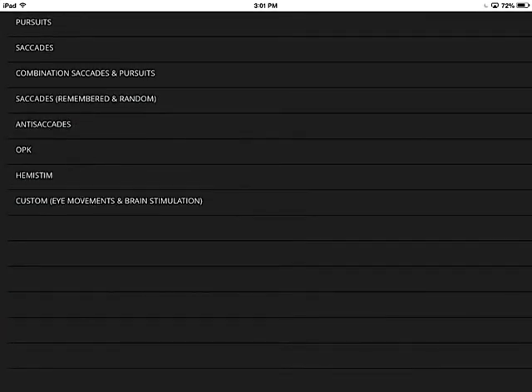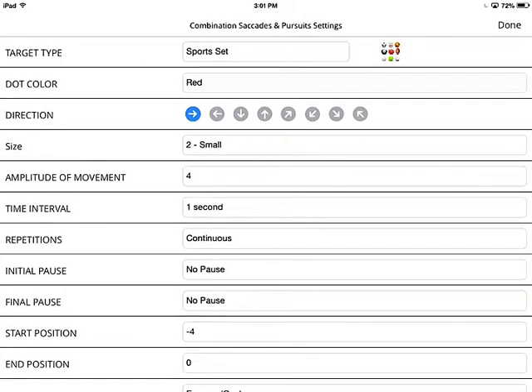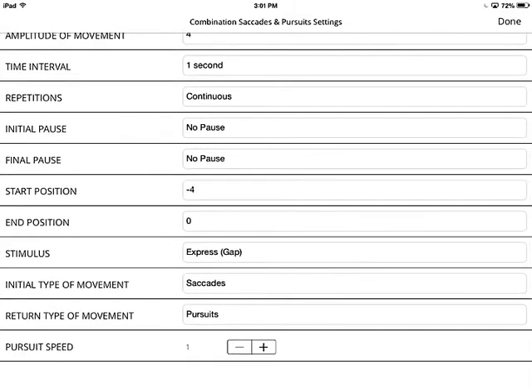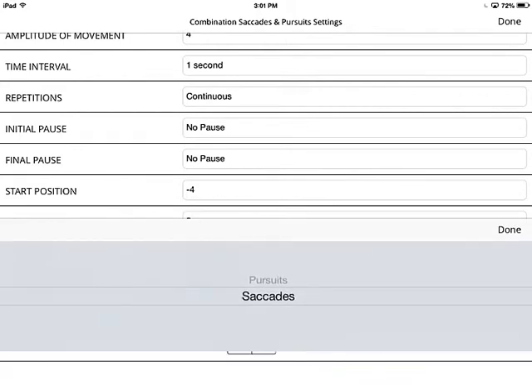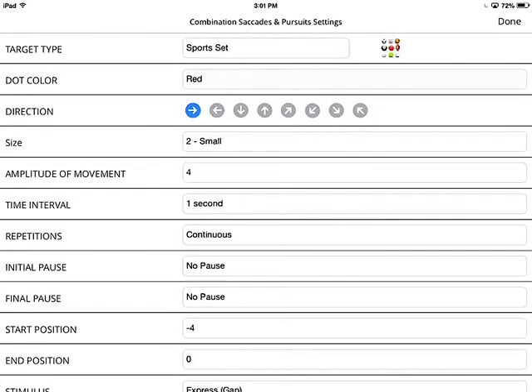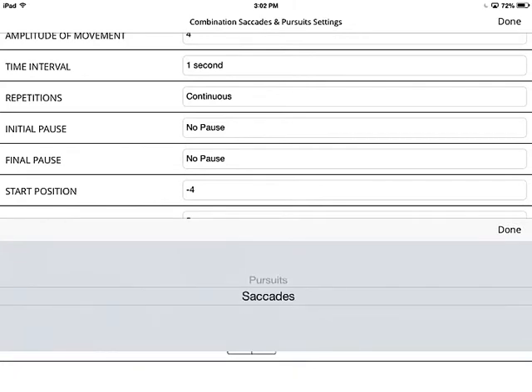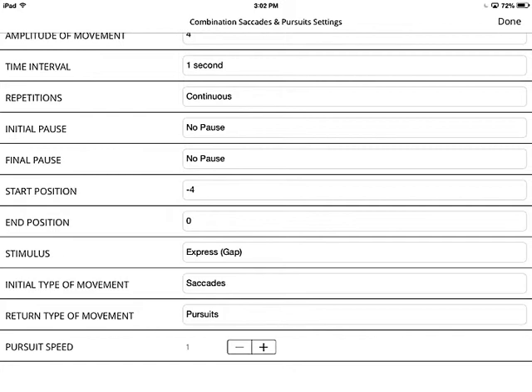Now, when you go to combination saccades and pursuits, it's really the exact same principle — all the features are the same. The main difference is at the bottom, where you can choose whether the initial movement is a saccade or a pursuit. We'll leave it as a saccade, with the return movement being a pursuit. You could switch it around, but in this exercise you cannot make both directions a saccade — you can do that in the custom exercise, but not in the combination saccades and pursuits.